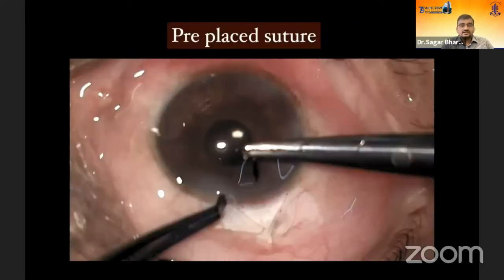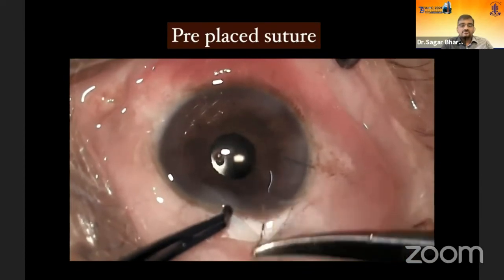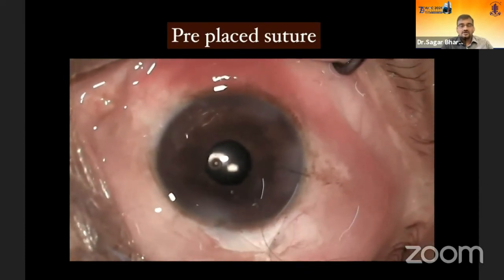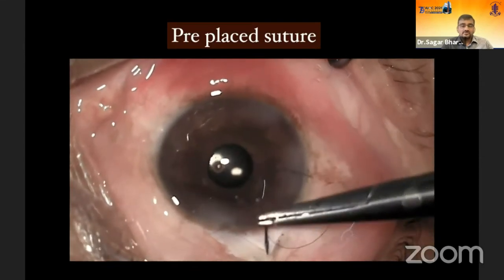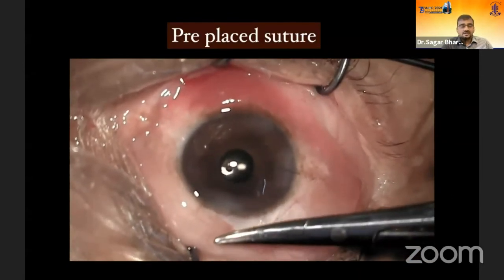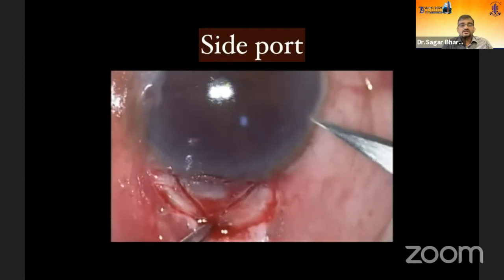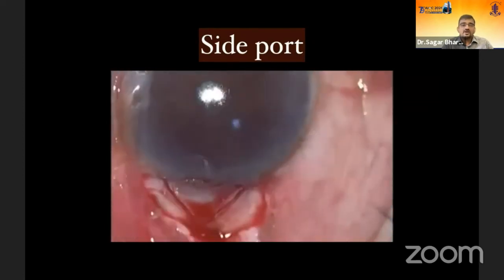After mitomycin, proceed with routine surgery and place a pre-placed suture. Pre-placed sutures are important because once you've done the sclerotomy, you want to close the globe as soon as possible to avoid prolonged hypotony on the table, which can give rise to choroidal detachment and other issues. Before making the sclerotomy, do a side port entry — it should be long and small — which allows very regulated release of aqueous from the anterior chamber. This ensures no sudden decrease in IOP during sclerotomy, preventing complications like suprachoroidal haemorrhage, especially in angle-closure and small eyes.